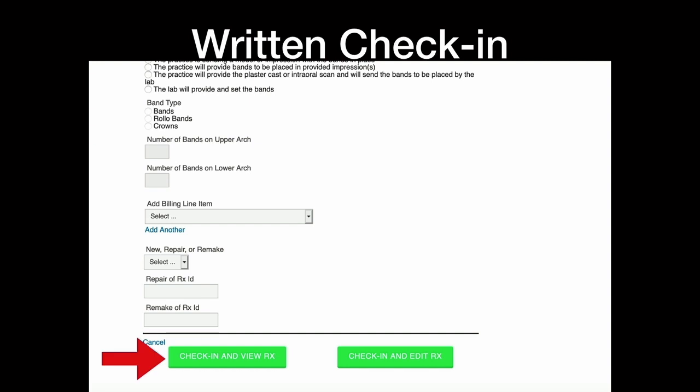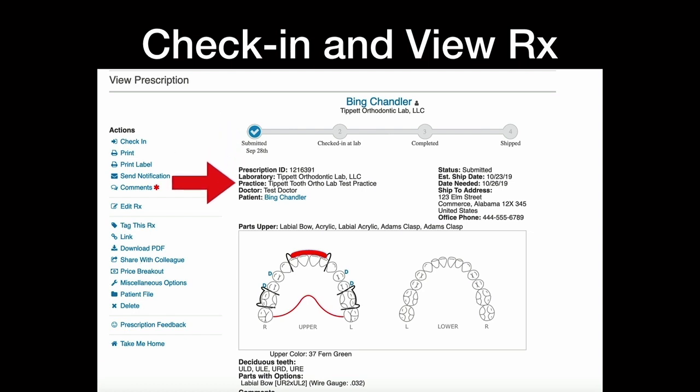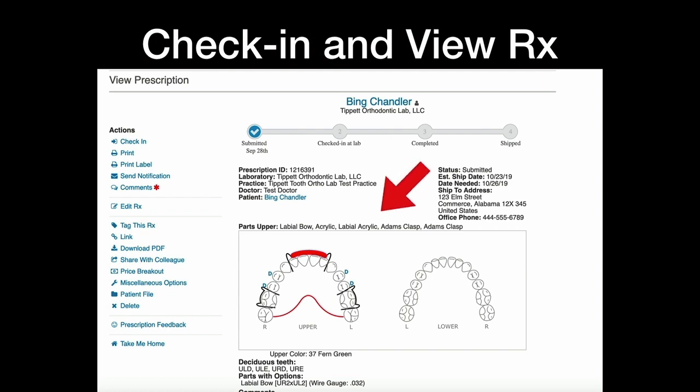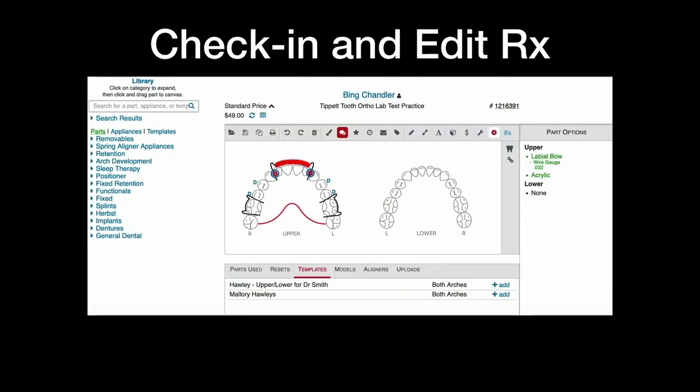And then check in and view Rx. And then there's also check in and edit. There's two different paths. The view is the digital version of the paper. So you can actually have a paperless lab if you want. You just have your laptop, your iPad or whatever, and you get all the information on here. You get that same progress bar that the doctors get. You get of course all the information, all the shipping, you get a parts list. You can download the PDF if you still want paper. And then edit Rx.